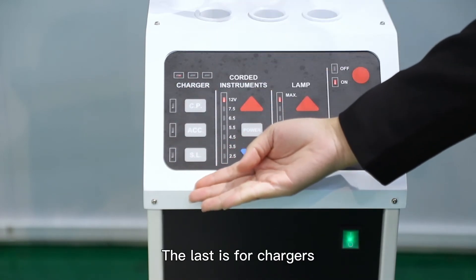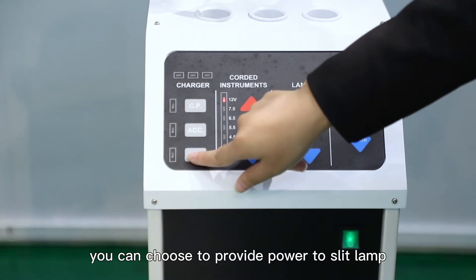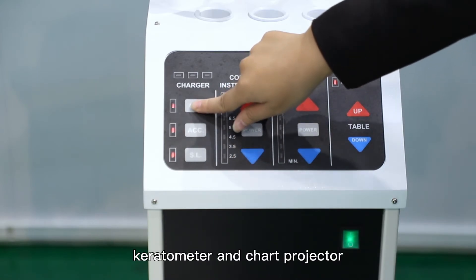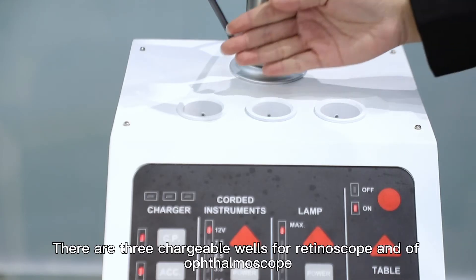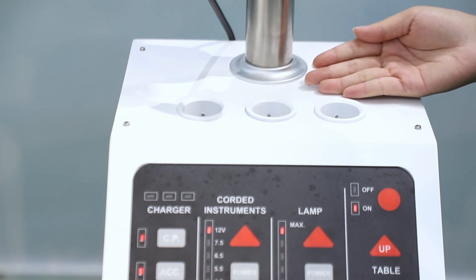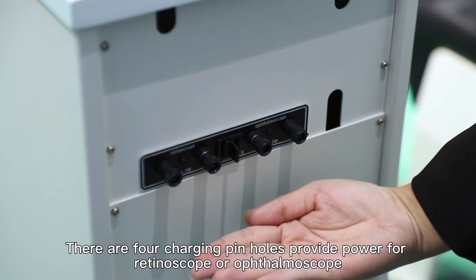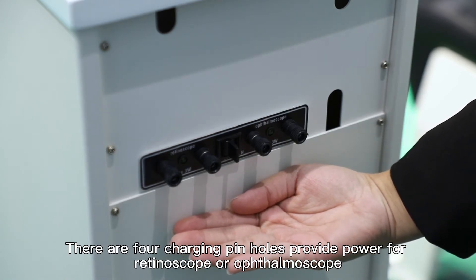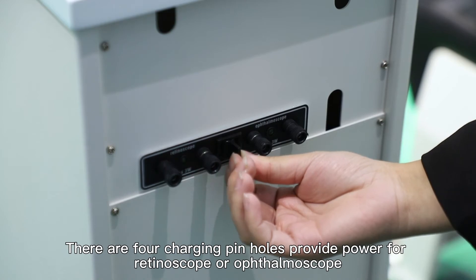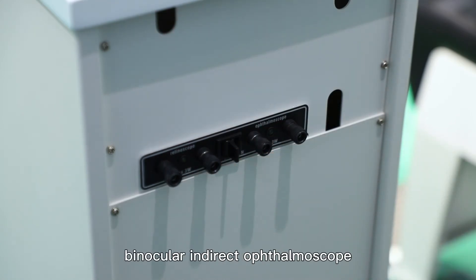The last area is for chargers. You can choose to provide power to the lamp, keratometer, and chart projector. There are three charging wells for ophthalmoscope and retinoscope. This is an indicator of the charging wells. There are four charging pinholes to provide power for retinoscope, ophthalmoscope, and also BIO — binocular indirect ophthalmoscope.